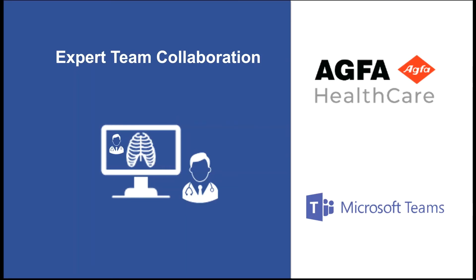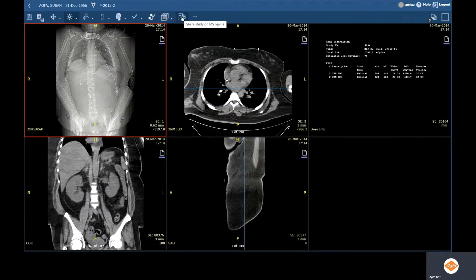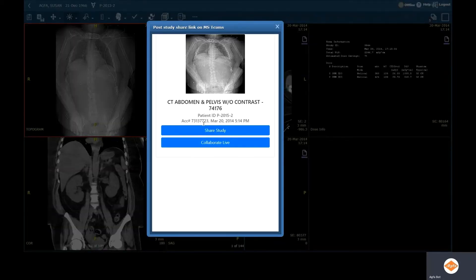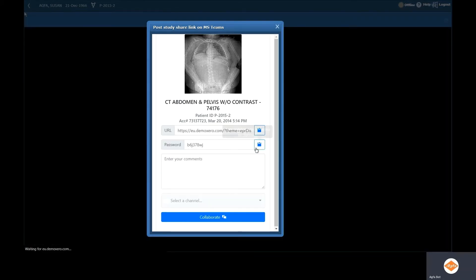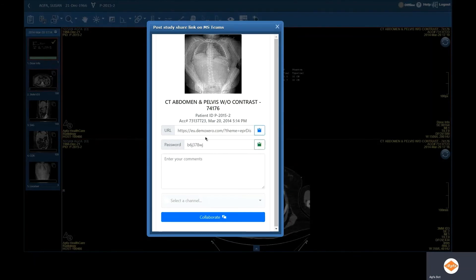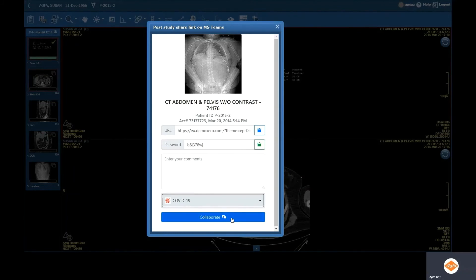The second use case shows the expansion towards collaborative sharing and interaction with images between different groups of users in Microsoft Teams. As part of the innovative partnership between Agfa Healthcare and Microsoft, Agfa Healthcare has created a live broadcast of medical images within Microsoft Teams. To begin a broadcast, you simply select the Teams sharing icon, then select the 'Collaborate Live' option. Within here, you can copy the link into an existing meeting or send a message with a card directly to a channel. There is a secure password enabled so that you can access those diagnostic quality images using Agfa Healthcare's streaming technology.